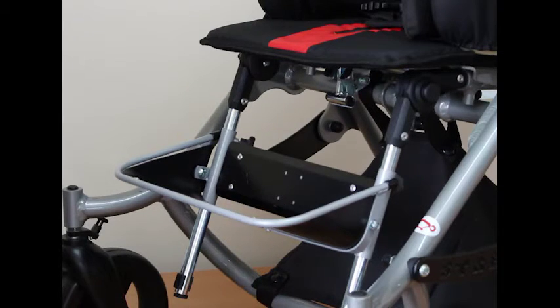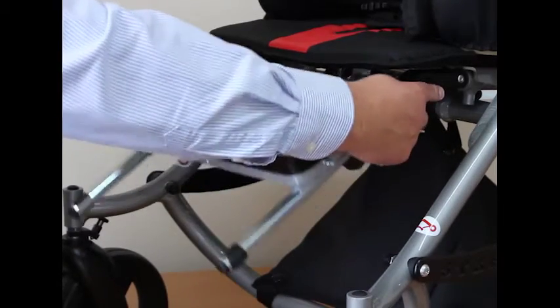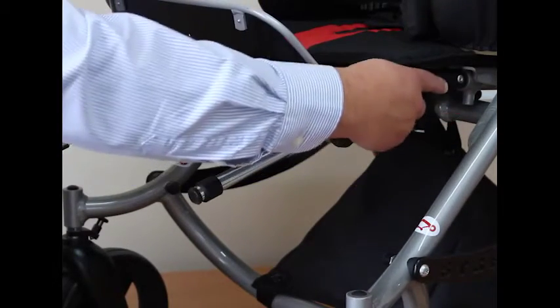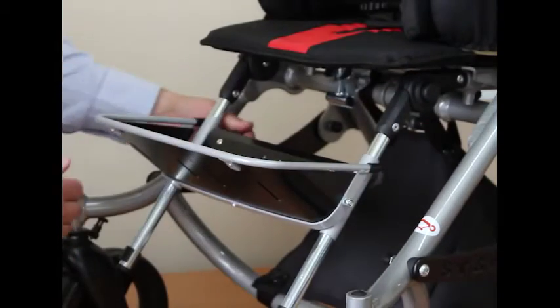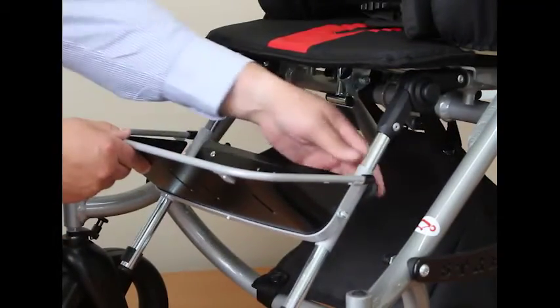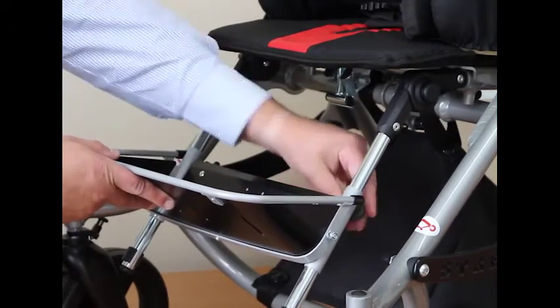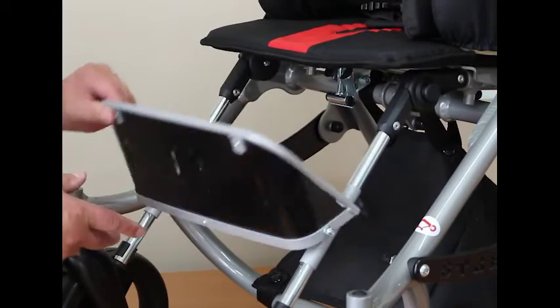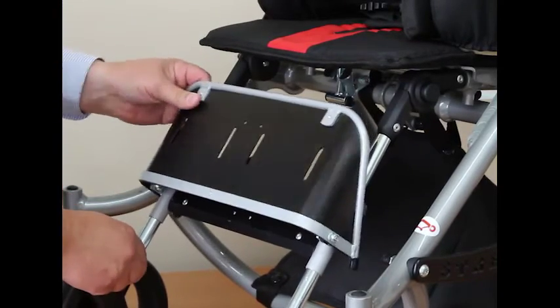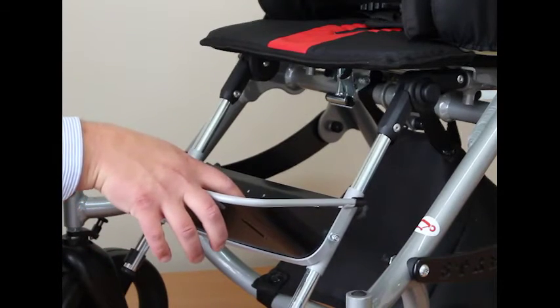The footrest is also angle adjustable by pressing the buttons on both sides — you can then release and reset. The height of the footplate can also be altered by releasing the two fixings and choosing the new position on the rails. The footrest folds up for loading and unloading, and you can also attach ankle huggers and foot straps to the footboard.